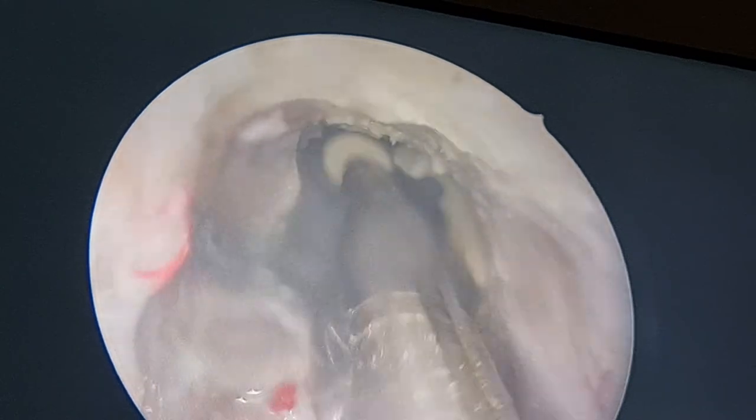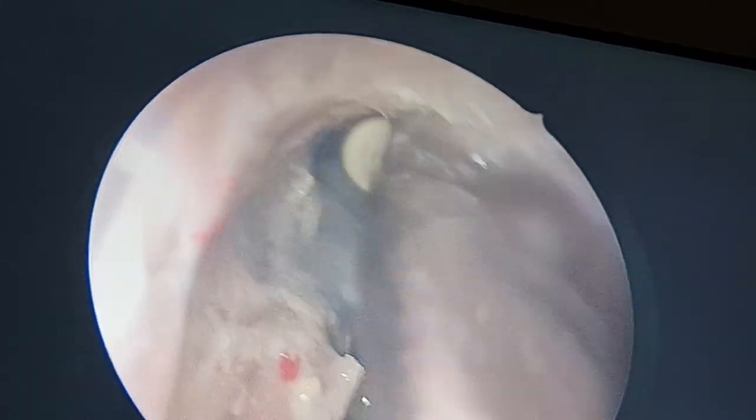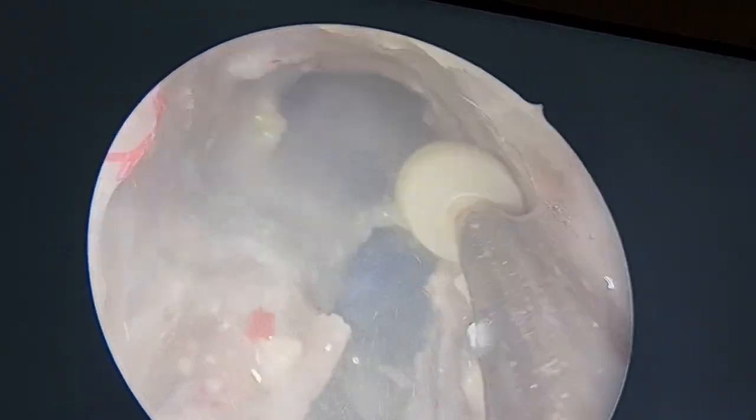This is 2B. The septum is left. Yeah, that is 2B. Septum is taken out, then it is to be. No, not taken out. Septum is never taken out in a unilateral approach. That's what I'm telling you. I'm coming to you with a modification. That's 2B, Draf 2B.